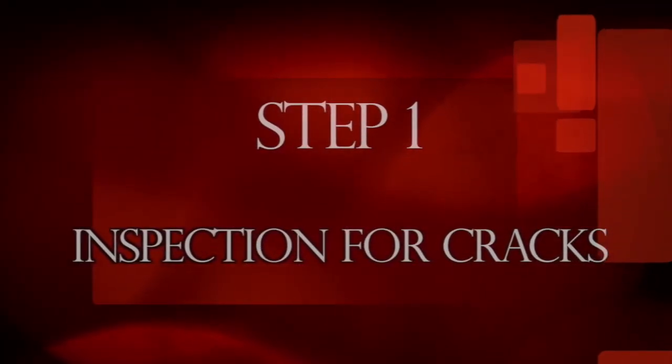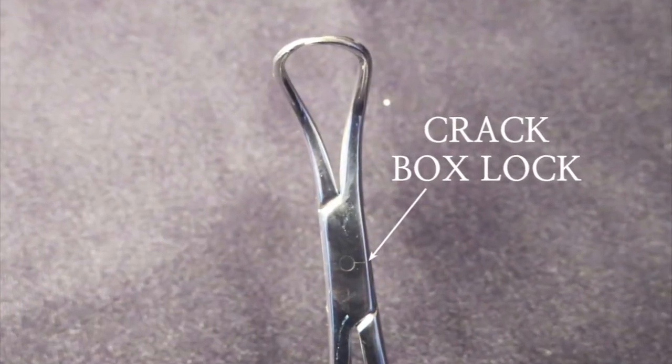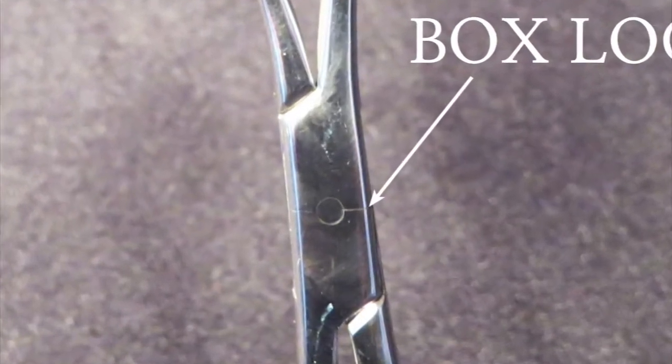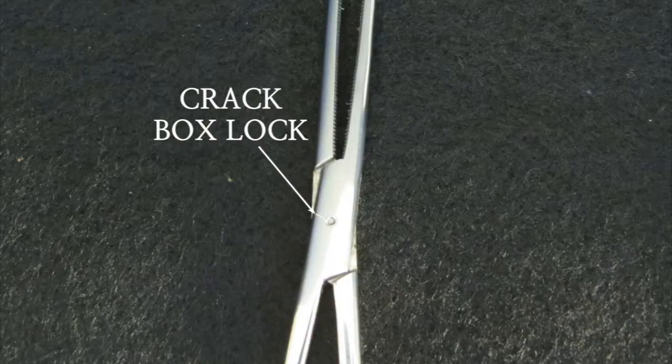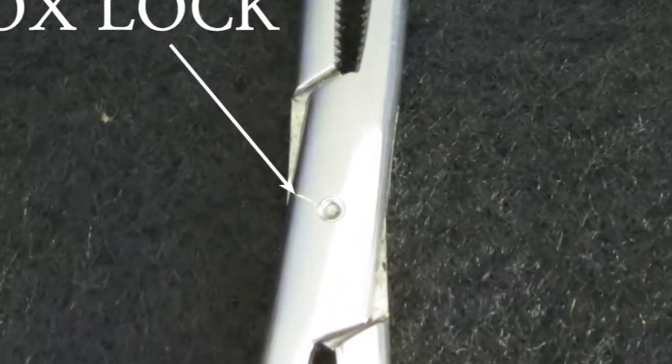Step one: inspection for cracks. Inspect all instruments for cracks. If any cracks are discovered, the instrument must not be used. The most common cracks found on ring forceps will be noticed on the box lock between the pin and the outer edge.